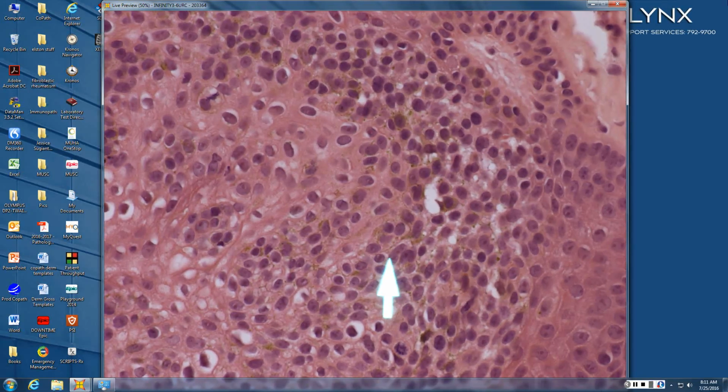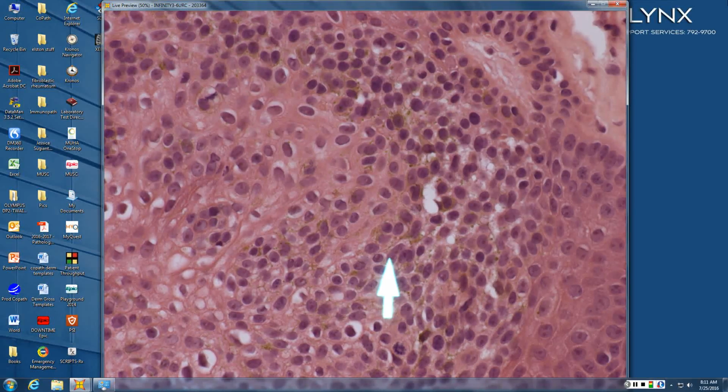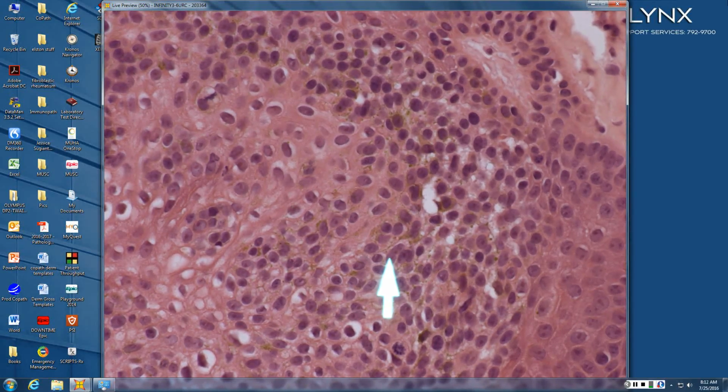Do you have a name for such a lesion? A melanoacanthoma. Absolutely correct. So a melanoacanthoma of skin is a type of seborrheic keratosis where the pigment is contained largely within the dendrites of highly dendritic melanocytes. A melanoacanthoma of the oral mucosa is a benign reactive lesion that's not neoplastic at all, but has some histologic similarity.